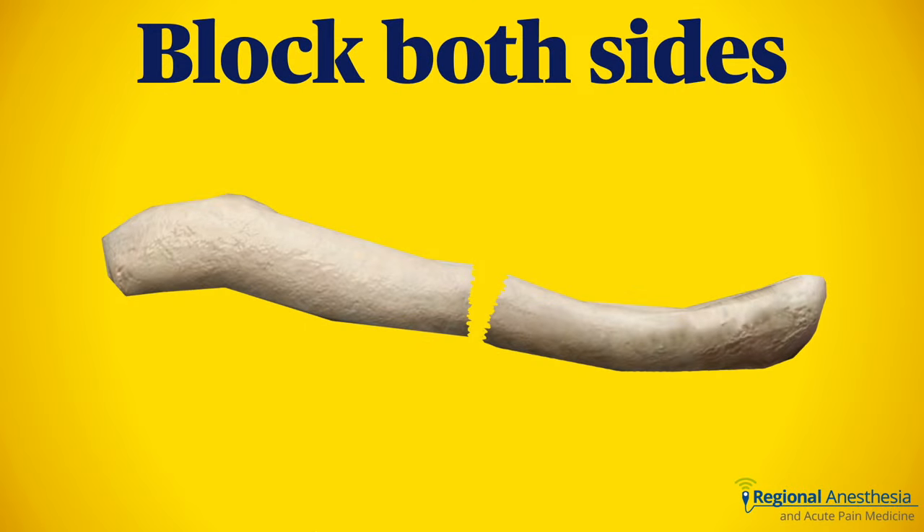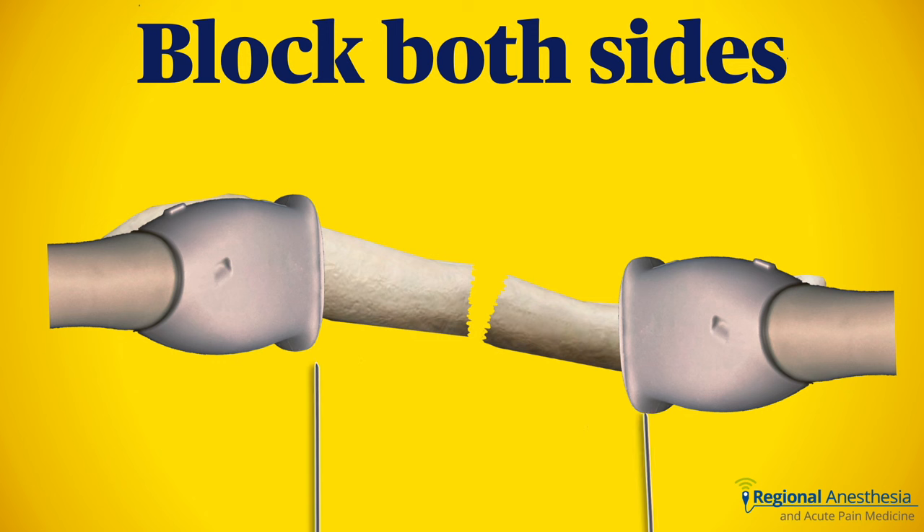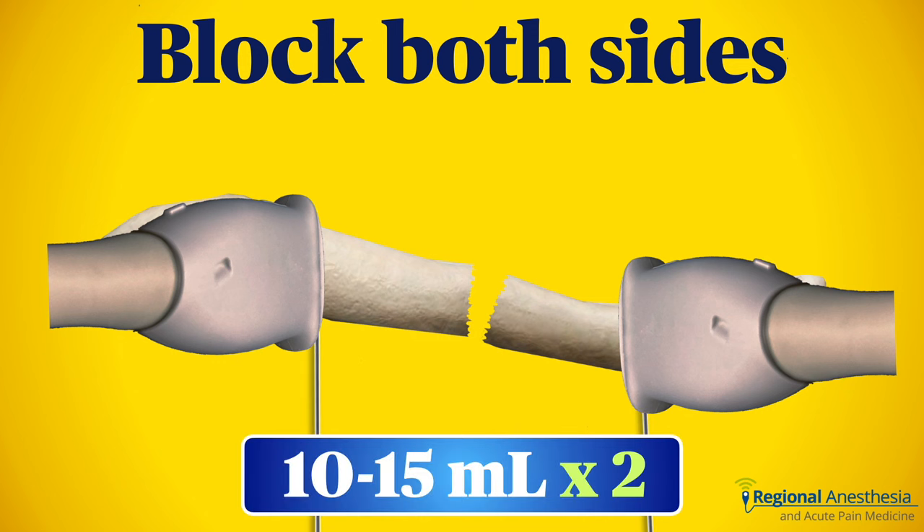Because the fracture is likely to interrupt the integrity of the fascia, it's a good idea to perform this block on both sides of the fracture. We'll put 10 to 15 mLs of 0.2% ropivacaine at each site. If we're after quick onset and surgical anesthesia, consider increasing the concentration to 0.375 or 0.5%. If the fracture is near one end, the double injection may be tricky and you may have to settle for one injection.